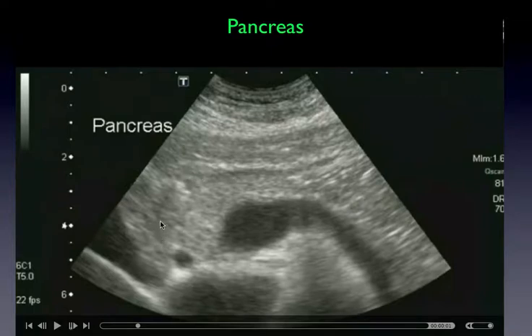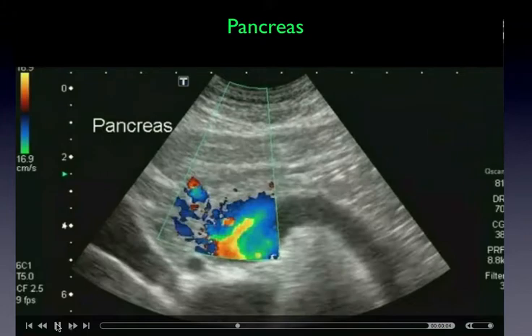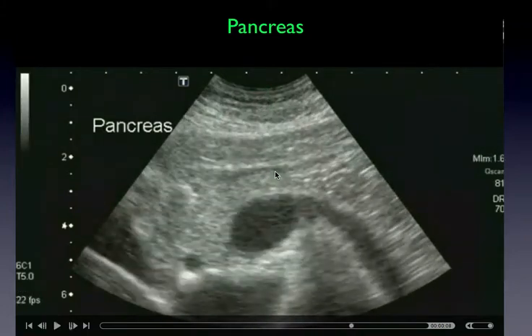You can actually make out the edge of the pancreas here. So what's in this direction? We know duodenum's over here. We know spleen is over here. Up here is stomach. So this is coming from the stomach, I believe. And now we'll see, again, vascular. Well, they were thinking the duct isn't vascular, but neither is the stomach.